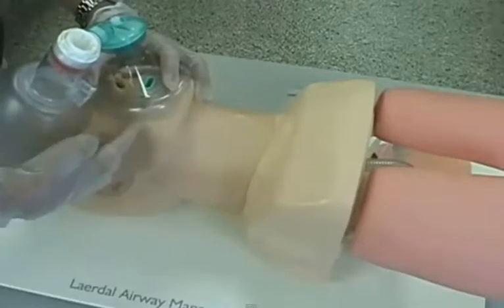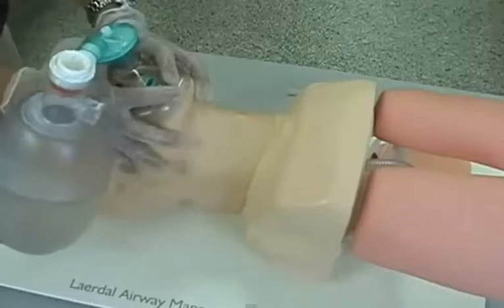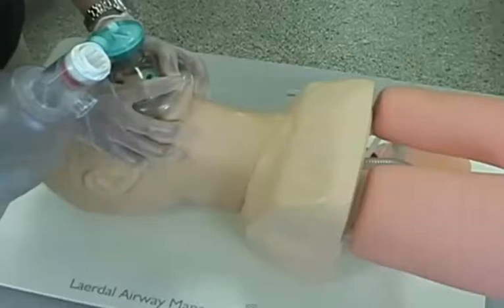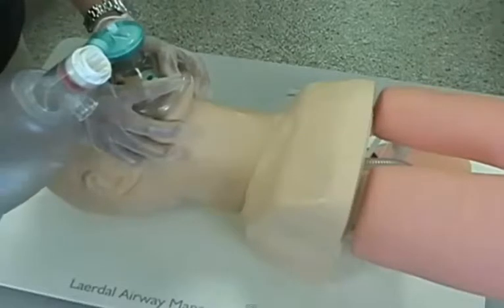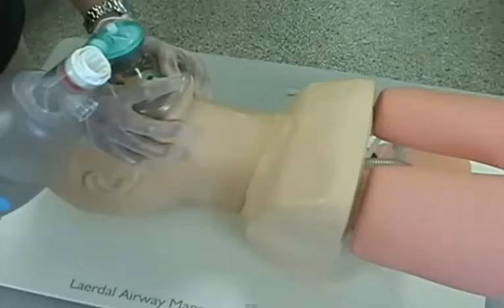Now if you're having trouble getting a seal, or if resources permit, a 2-hand face seal is superior to a 1-hand. Very easy to pull up on the jaw and to maintain an excellent seal, and then you can have another rescuer do the ventilations, squeezing the bag. So this technique is really the preferred. If you have the resources, we strongly advocate the 2-handed technique.